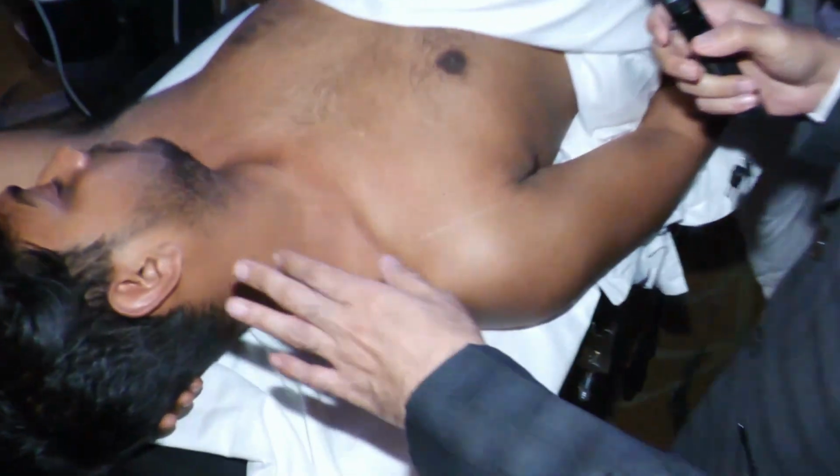So for supraclavicular interscalene, make sure that the hand should go towards the knee. This way the space opens up. Okay, this is one of the tips. And you can have a wedge in between the two scapula to make the plexus rise.